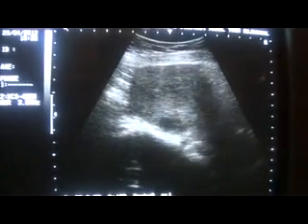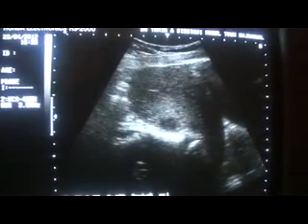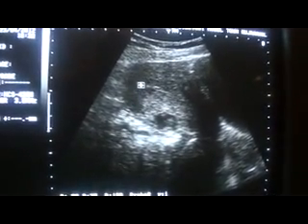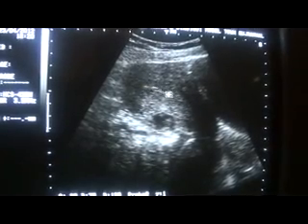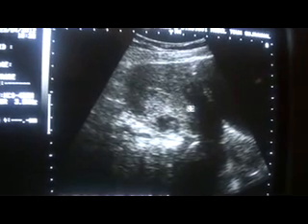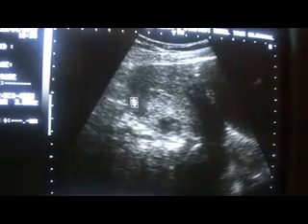So most of these focal lesions are seen in the posterior wall, and almost all are well demarcated, are echogenic in the center, hypoechoic at the periphery, few are hypoechoic. This is in the upper segment, which is totally hypoechoic, and there are a few subserosal fibroids in the anterior wall, one of which we just saw.